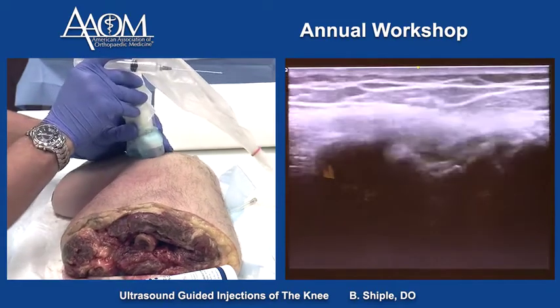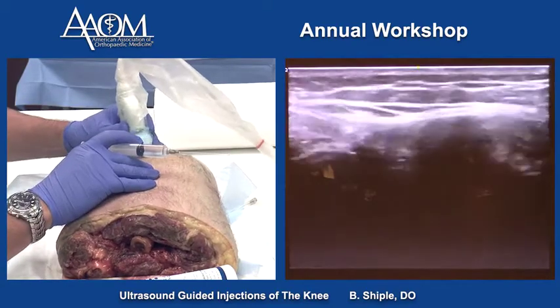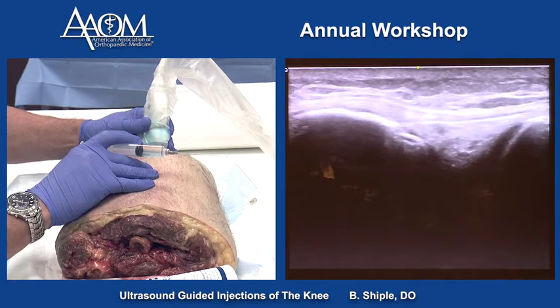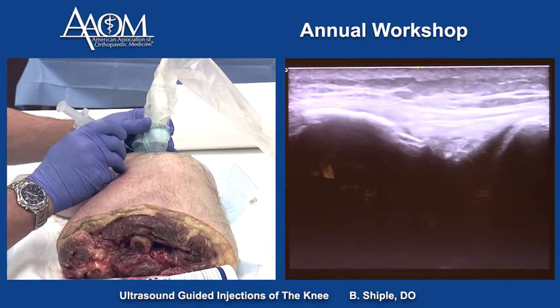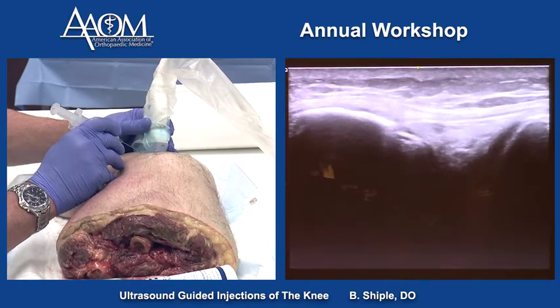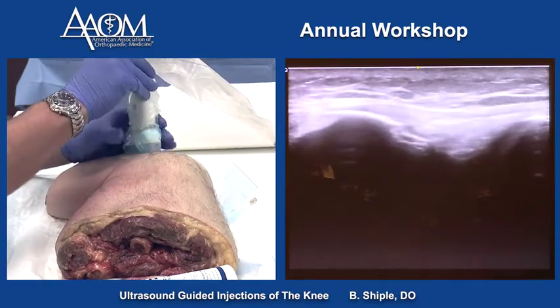The only other area we haven't shown is the IT band insertion, which is right there — that's a good shot of the IT band. We can inject that short axis or long axis. That's a short axis technique at the insertion area, and it is a very effective treatment technique.